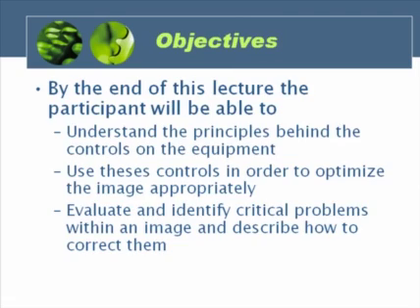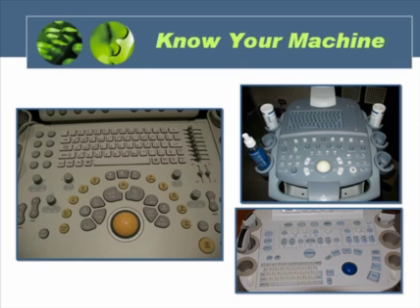the best image. By the end of this lecture, you should be able to understand the principles behind the controls on the equipment, use these controls in order to optimize the image appropriately, and evaluate and identify critical problems within an image and describe how to correct them.